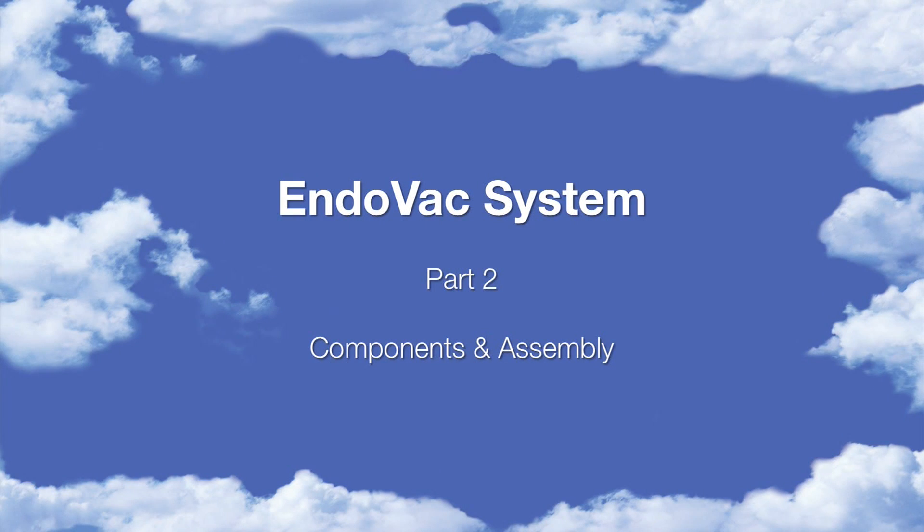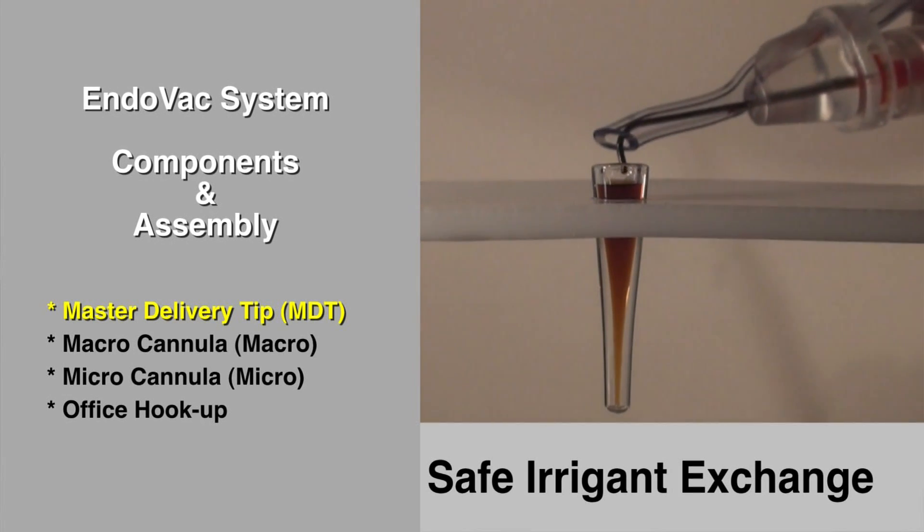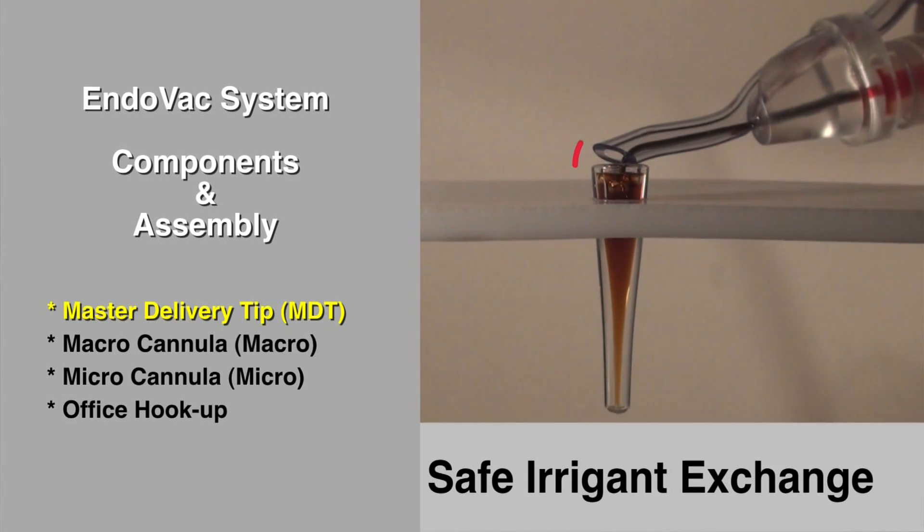The Endovac system is comprised of three components. The first used during treatment is the master delivery tip. It delivers irrigant from this tip and aspirates the excess through this tube. As shown here in slow motion, it enables the clinician to maintain a pulp chamber brim full with irrigant at all times.